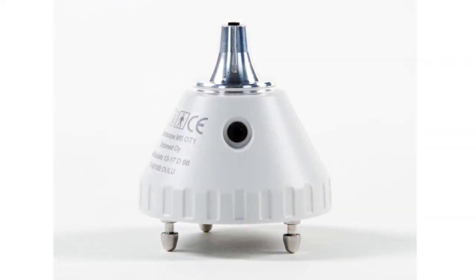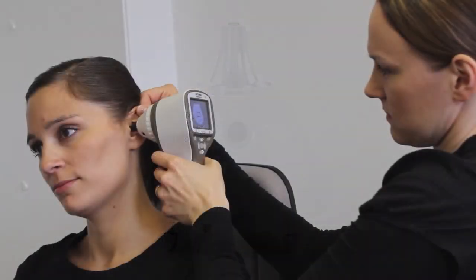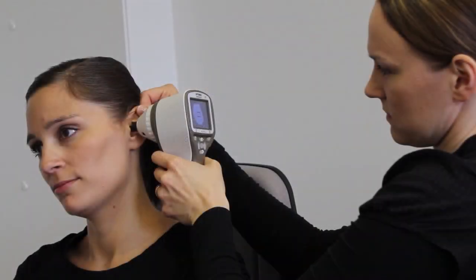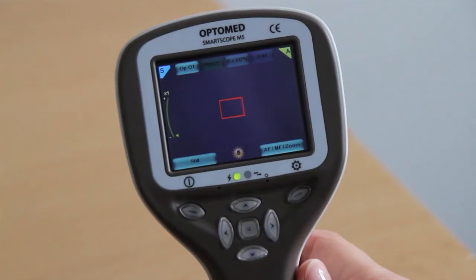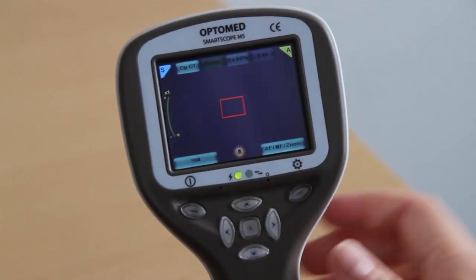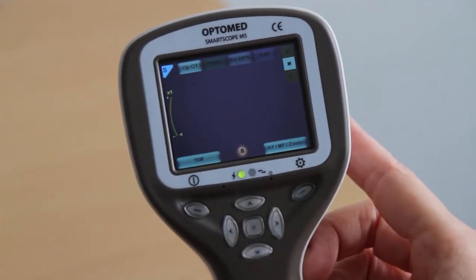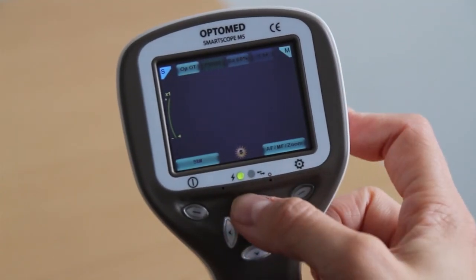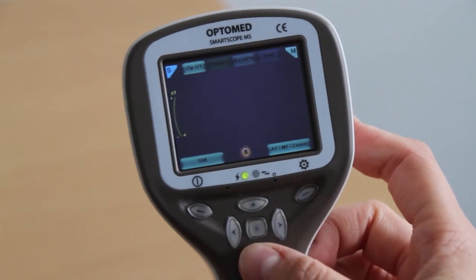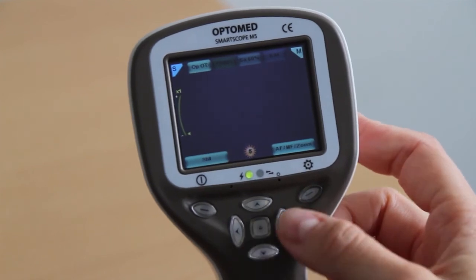Next, we will go through the steps of performing an otoscopic examination to ensure optimal image quality with the SmartScope OT1. To ensure the camera is stable for imaging, it is recommended that both the patient and examiner are seated. Select the preferred focus mode by pressing the right soft key. It is recommended to use autofocus.